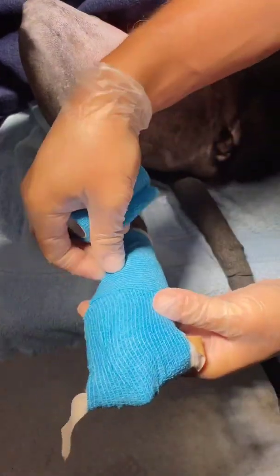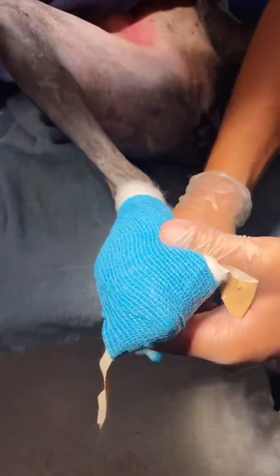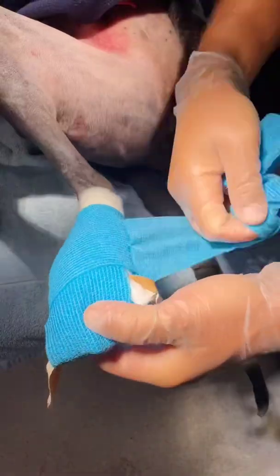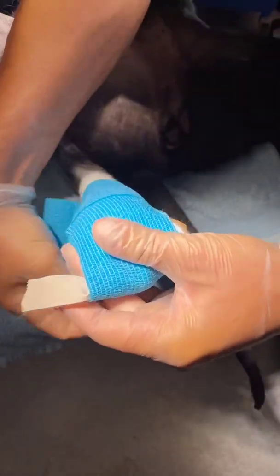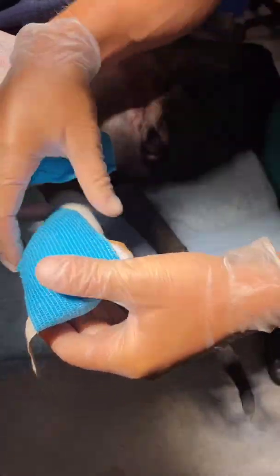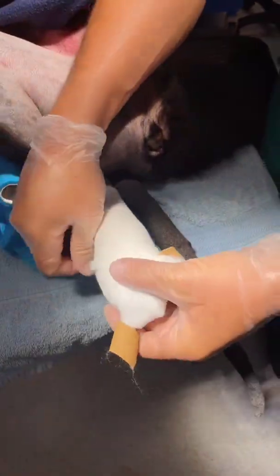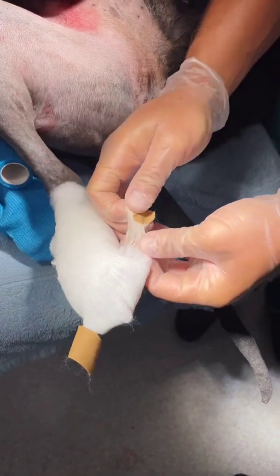Now, the thing I haven't done — as Jeff is just pointing out — is that I haven't folded my stirrups back. We've made an error on the vet wrap. This is what happens in real life: you get distracted and then you've gotta refocus on what's going on. So we're gonna unfold our stirrups here.